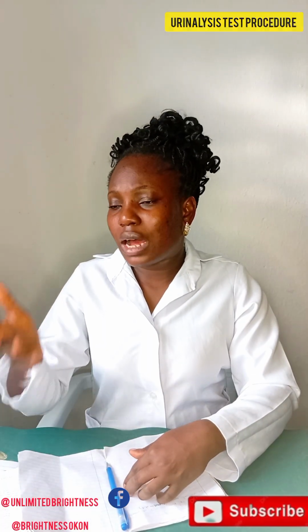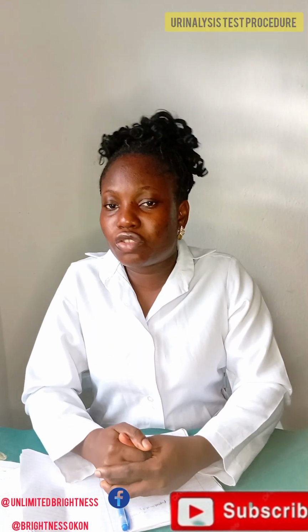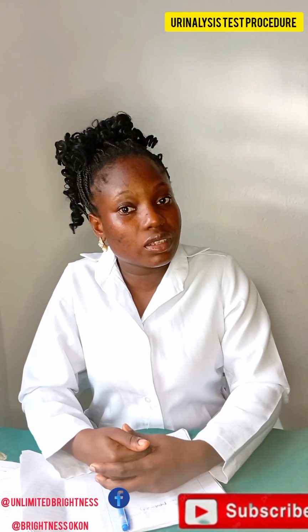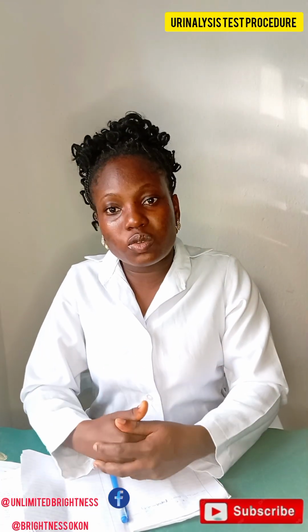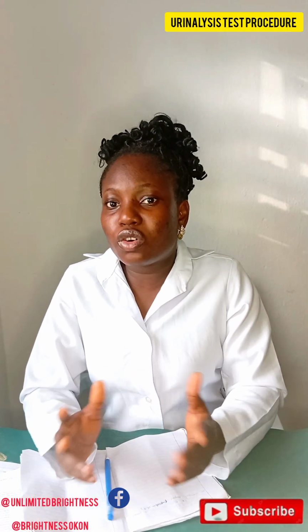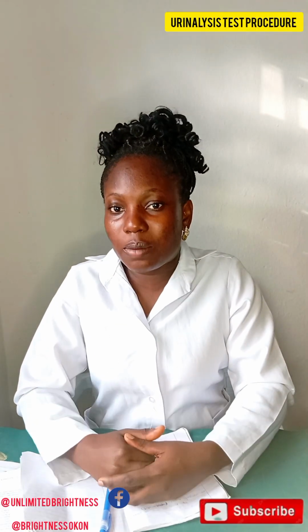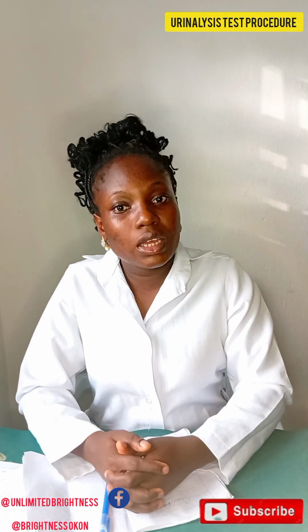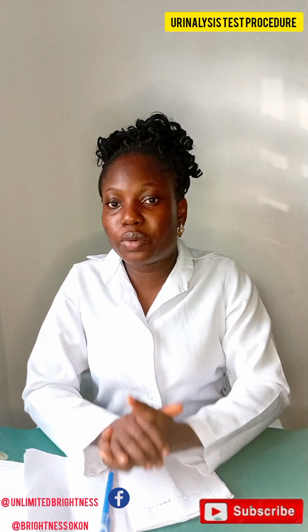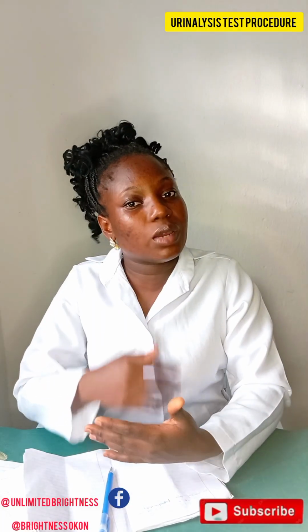Other abnormal constituents include protein. If protein is found in your urine, it could be a result of urinary tract infections and other causes. Then another abnormal constituent is glucose. If glucose is found in urine, it is also a call for alarm. Previously, I talked about glucose as a core topic. Glucose is the fuel for the brain. It is found in the blood. If found in urine, it is a problem.